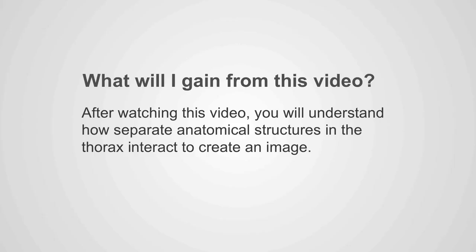What will I gain from this video? After watching this video, you will understand how separate anatomical structures in the thorax interact to create an image.